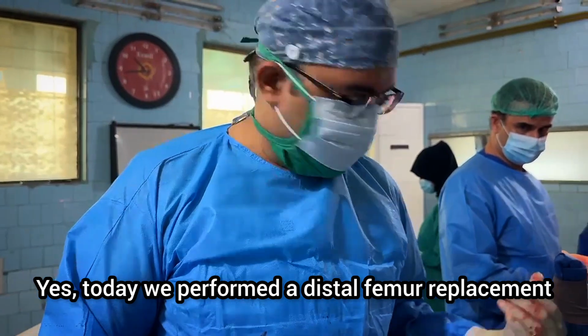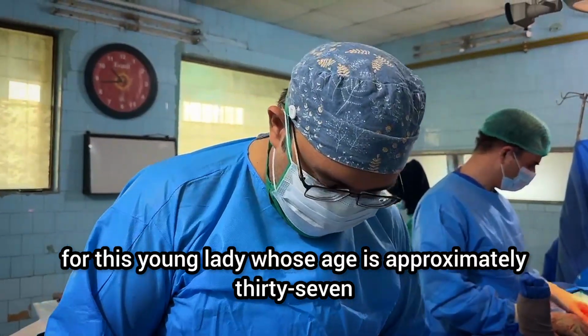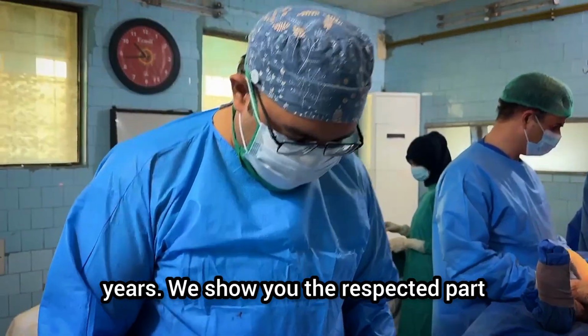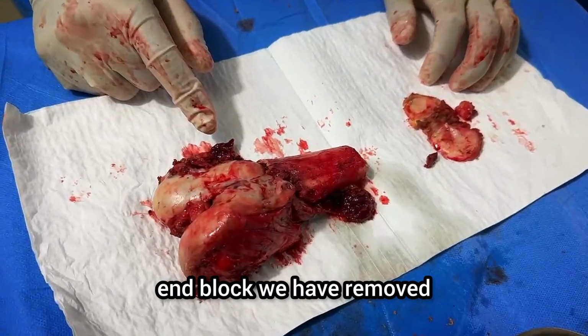Today we have performed a distal femur replacement for this young lady, who is about 37 years old. Now we'll show you the resected part, the end block that we removed. This is the distal femur part, the end block we have removed.